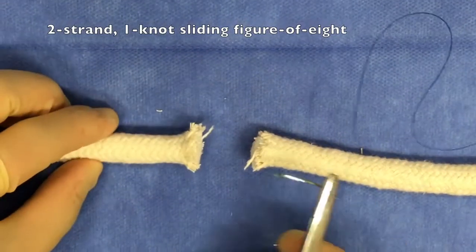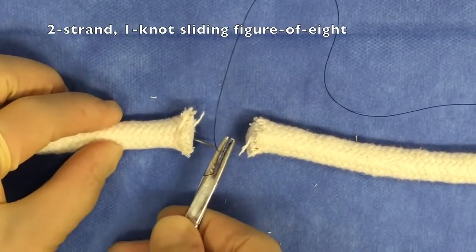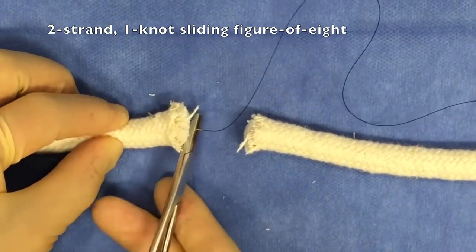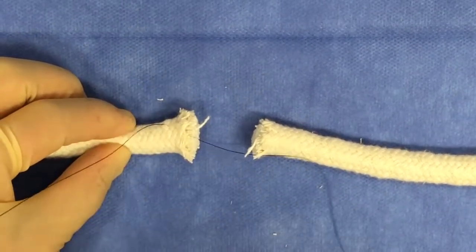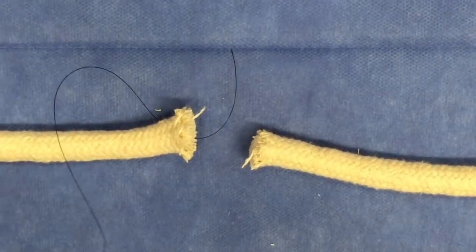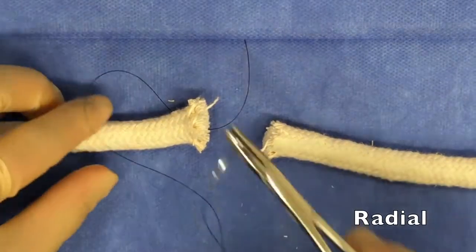To complete this video, let me just show you one other variation on this technique which is commonly reported, and this is a 2-strand, 1-knot sliding figure of 8 pattern. So really similar, but instead of a mattress pattern, you're going to use the figure of 8 pattern, which is also something that is familiar to most emergency medicine providers. So in this case, let's say you begin on the radial side of the tendon.